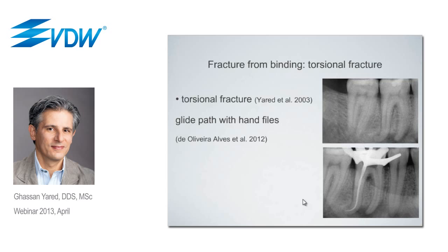However, if you look at the smaller one here, at the distal root, which has a severely curved canal, it is not easy to use hand files to create a glide path. No matter how skilled you are, it can be very challenging. We probably have to use number 8, number 10, and number 15 hand files here. And again, this can be extremely challenging.